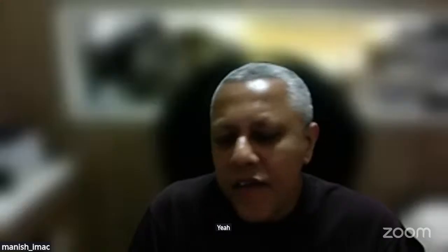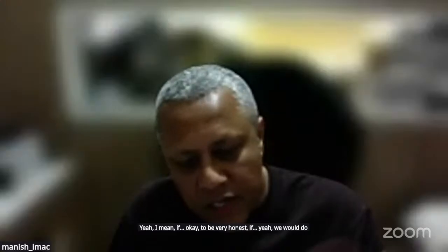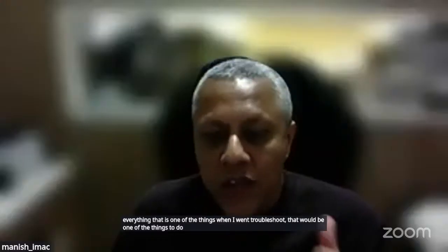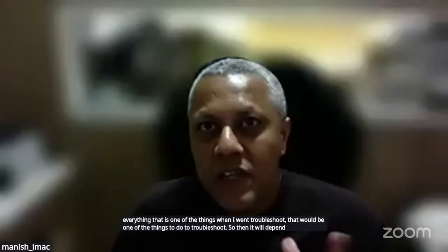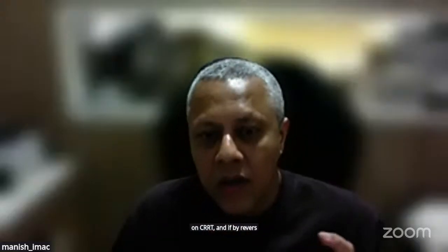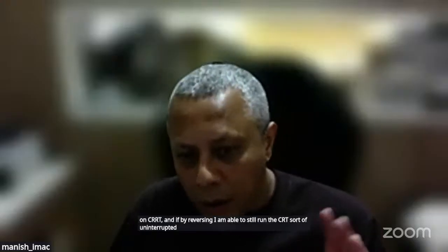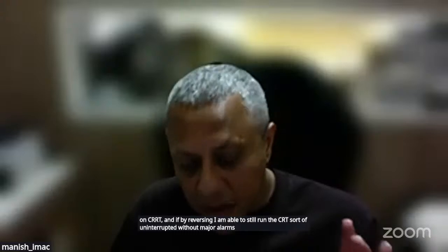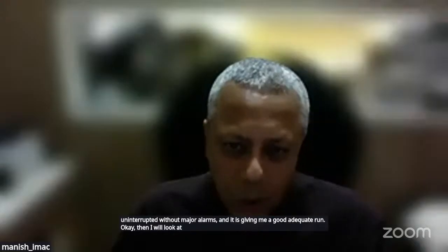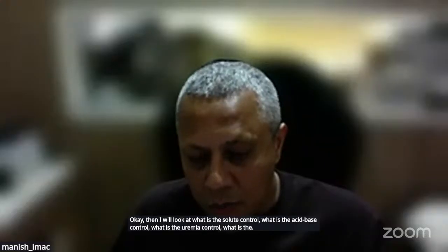Yeah, to be very honest, if we would do that, I think that is one of the things to do when I troubleshoot. So then it would depend. If these patients are on CRRT, and by reversing I am still able to run the CRRT uninterrupted without major alarms, and it is giving me a good, adequate run, then I will look at the solute control, the acid-base control, the uremia control, the potassium control.